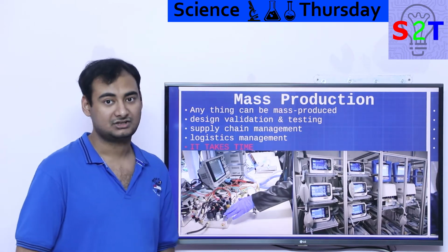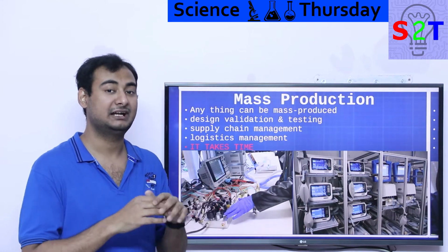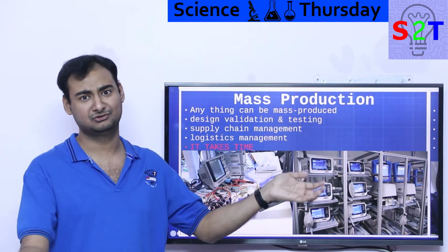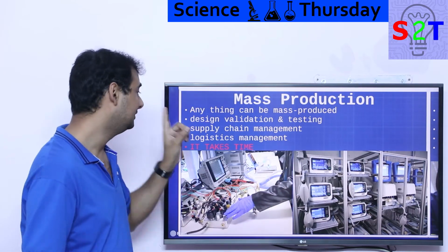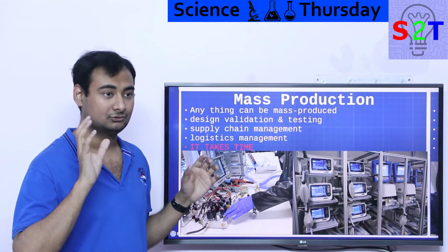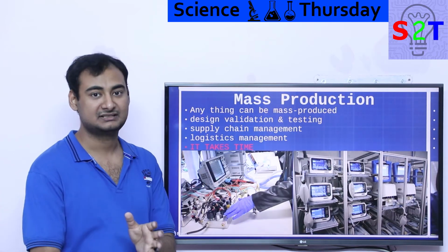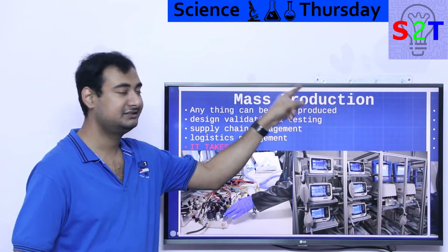because a ventilator is such a complicated thing. In terms of electronics, it's child's play. Even a normal Android phone is like, I have more than enough processing power to handle these few variables. I got this, not an issue. But the problem is the valves, the control mechanism, the moisture control. Those are physical entities. They require design validation. So you cannot just magically make something. You have to validate that, and testing is the hard part.